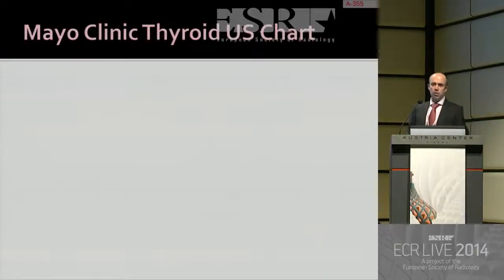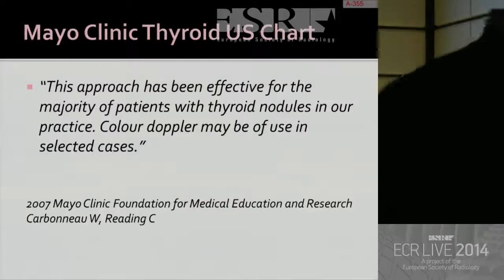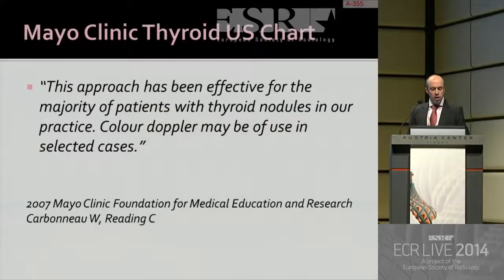This is from the Mayo Clinic Research Foundation, and the authors of this paper state with this chart this has been effective for the majority of their patients with thyroid nodules in their clinical practice. They may use Doppler flow in selected cases. And like I say, this is from the Mayo Clinic Foundation for Medical Education and Research. This is from a major US centre.